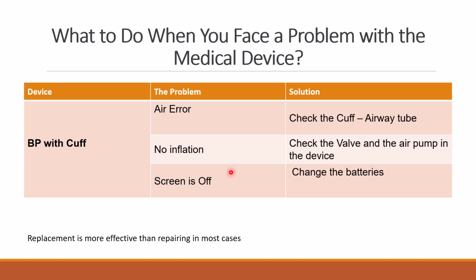It contains a compressor, flow meters, regulators, and transferring tubes to transfer the liquid or the air from point A to point B. So leaks are the most common, and the regulator settings are not good, especially for example in a dental unit.